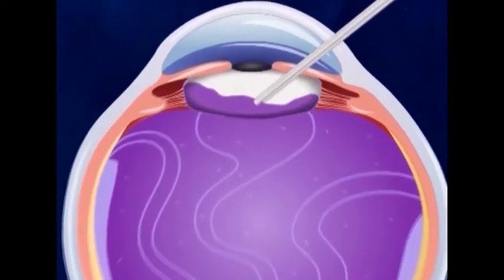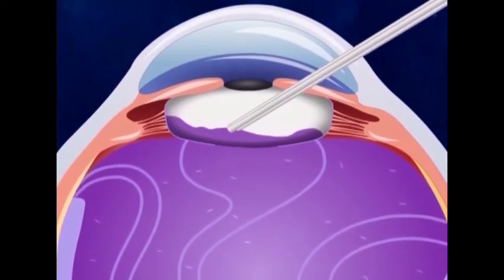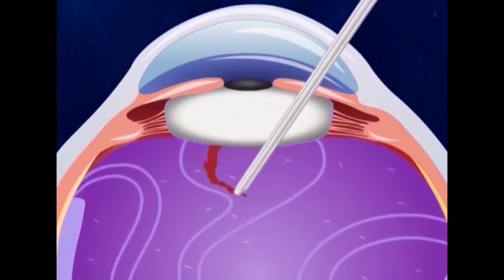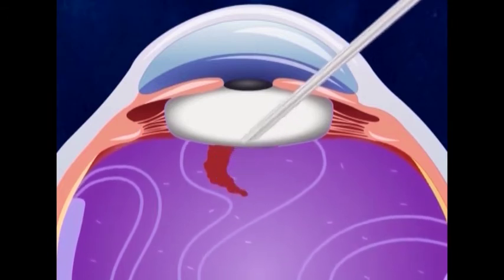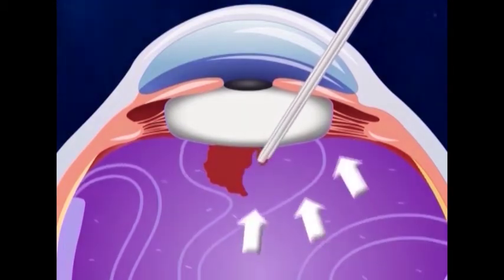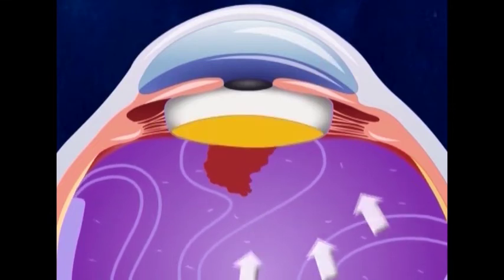This is exactly what happens in a limbal vitrectomy. The ergonomics of negotiating the vitrector through the capsular opening limits removal of the anterior vitreous to the area behind the PCR. This leaves behind pockets of anterior vitreous that are not removed, in turn leading to an asymmetric scaffold for the IOL.